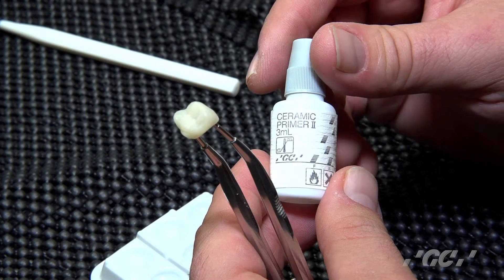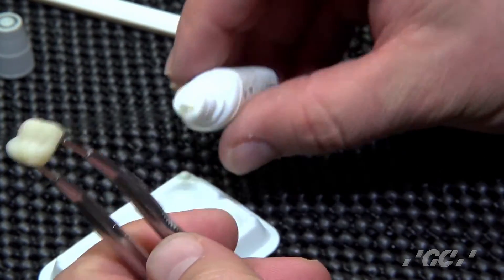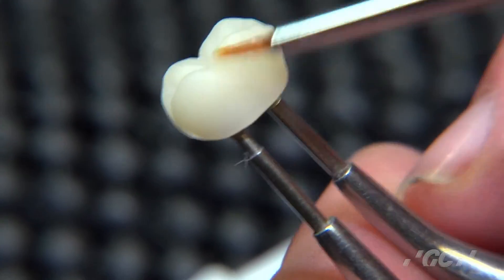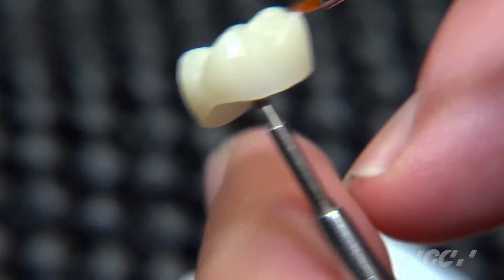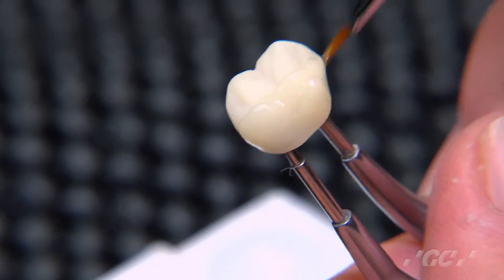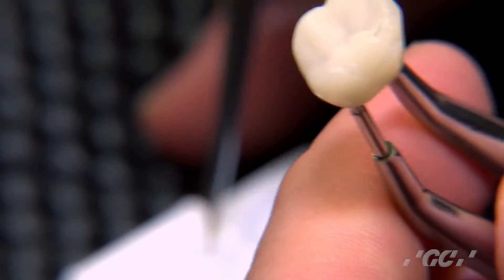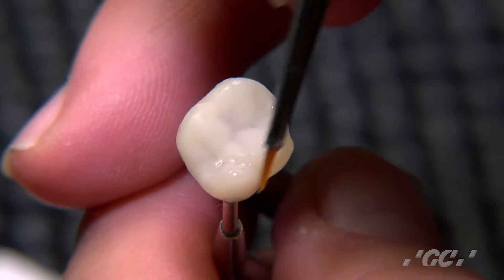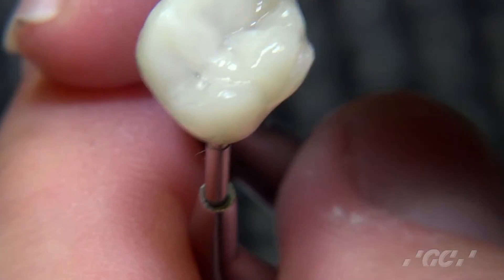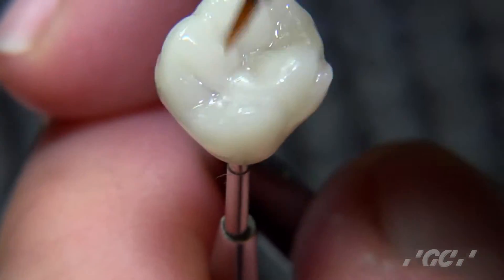To make sure we get the best bond possible, we use Ceramic Primer 2 — this creates a better layer for the OptiGlaze to adhere to. We take the brush provided in the OptiGlaze kit and apply the Ceramic Primer 2 all over the restoration. This step isn't 100% necessary, but studies show it gives you a better bond of the OptiGlaze color. Some may go directly to the OptiGlaze, and that's okay, but Ceramic Primer 2 will give you better adhesion that lasts over time.